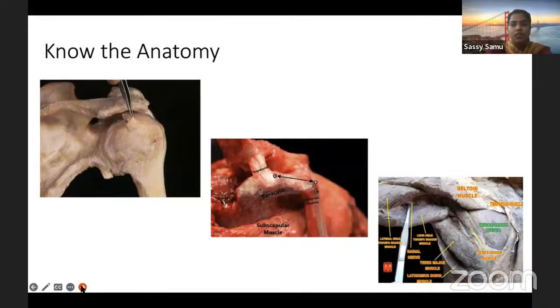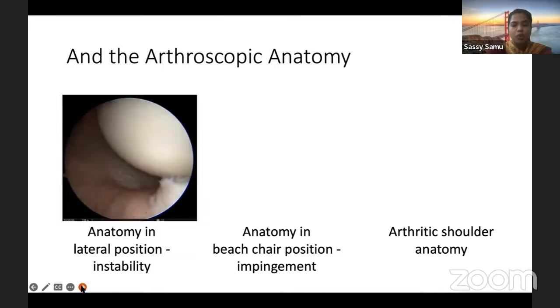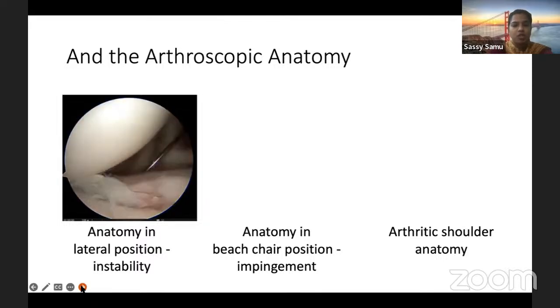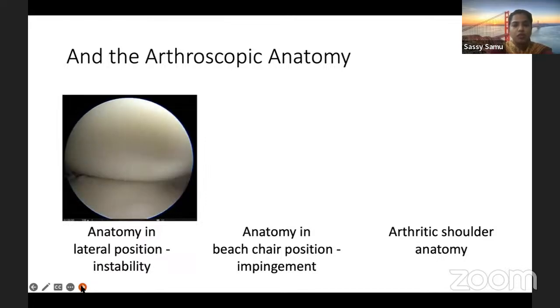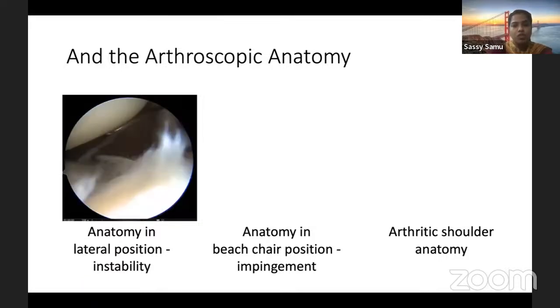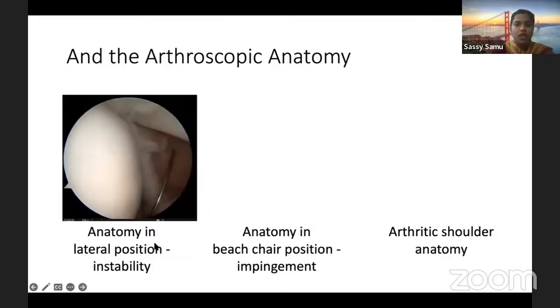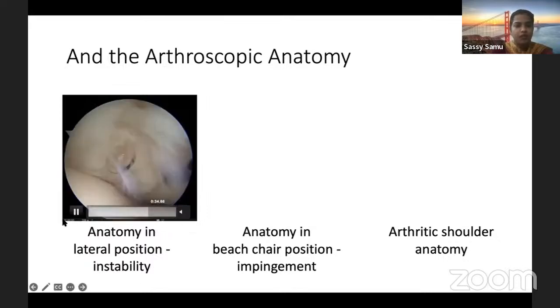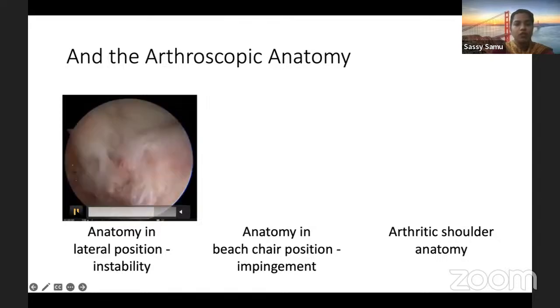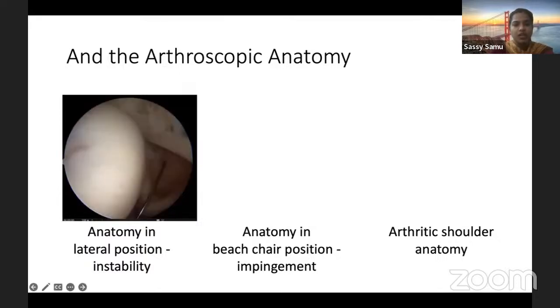What one has to understand is that the normal surgical anatomy, which we use for regular operating of fractures and other soft tissue injuries in shoulders, is different from arthroscopic anatomy. The arthroscopic anatomy is to be understood in 2 common positions which we use. One is the lateral position, another is the beach-chair position. In the lateral position, the glenoid is placed more horizontal to the floor and the ball is on the top. As you do the diagnostic, you get to see the anterior aspect, and then the rotator interval, which is bounded by the biceps superiorly. As you go up, you get to see the rotator cuff, the attachments, and coming back posteriorly, we get to see the bare area and then slide and get into the joint again.